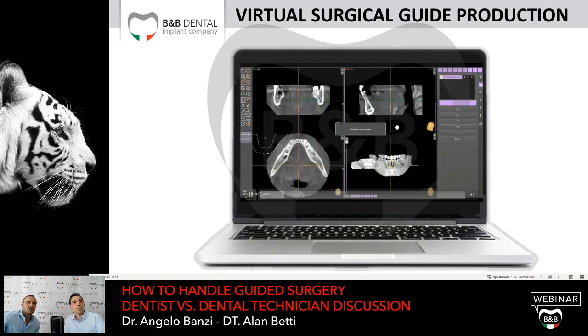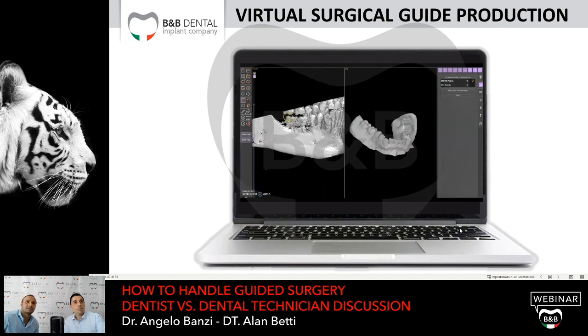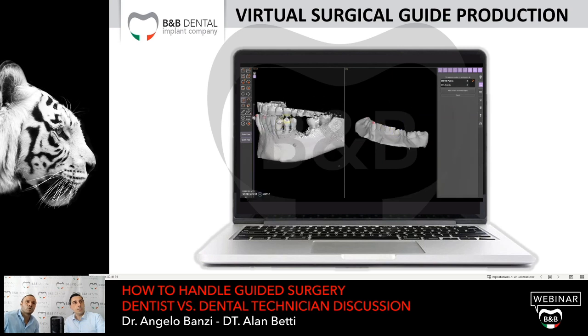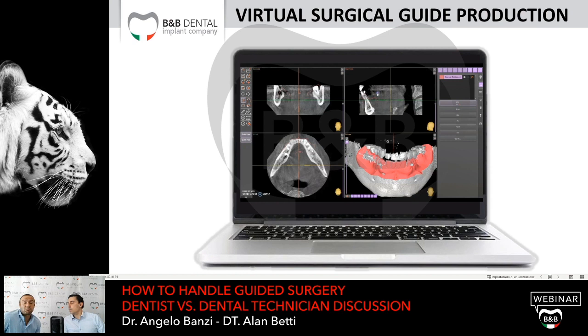And this is the matching, as he mentioned before, from the extraoral scanner. Again, we get the soft tissues and the teeth, and we got everything in the imaging, and this is actually the matching. This is the plaster model, and he is going to use just the teeth to match these two images. It's true that we also have the radiological template, and the radiological template will give us another piece of information for the matching.